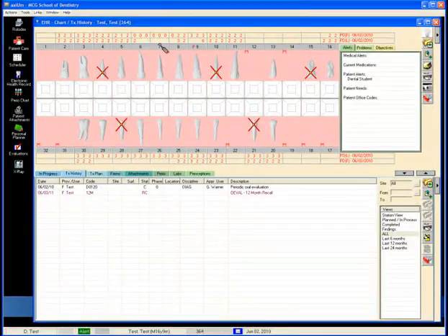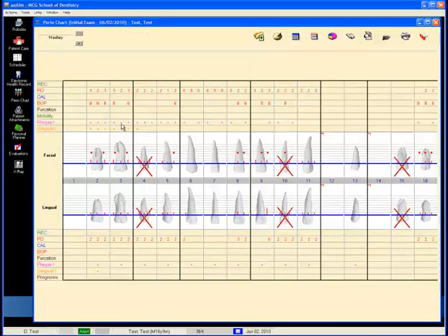You will have an exercise to create. You will have a test patient assigned to you. You will gain access to that test patient's record. You will be given some specific instructions written down on how to record and what to record for this patient. You will have an exercise in actually doing everything we've just completed. It's an exercise that should take you maybe 15, 20 minutes to complete the first time, and certainly much less than that later.